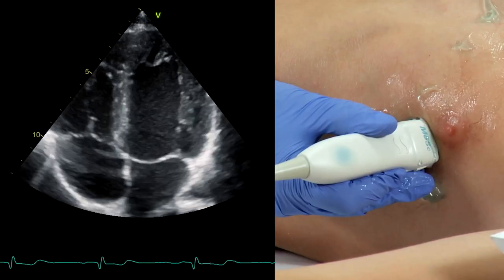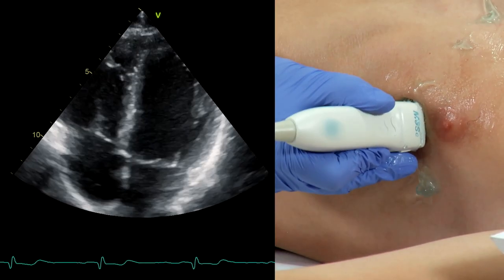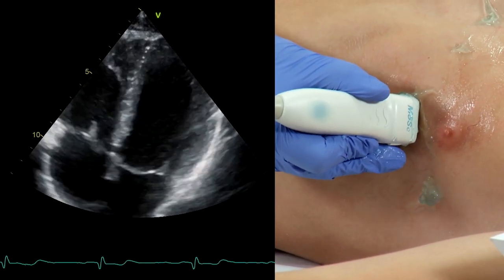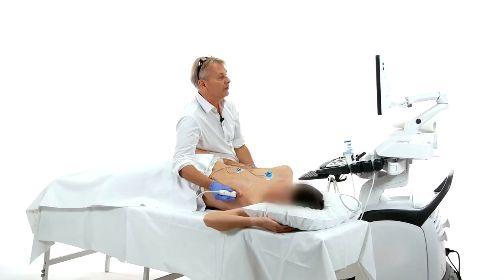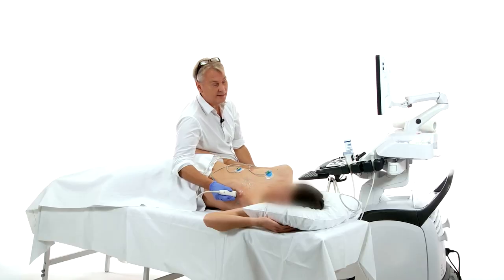The other thing you can do is optimize your image window so that you're not even close to where the lung is, and that obviously also gives you a much better image.